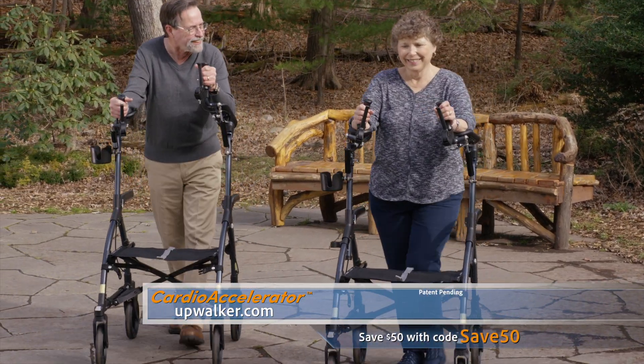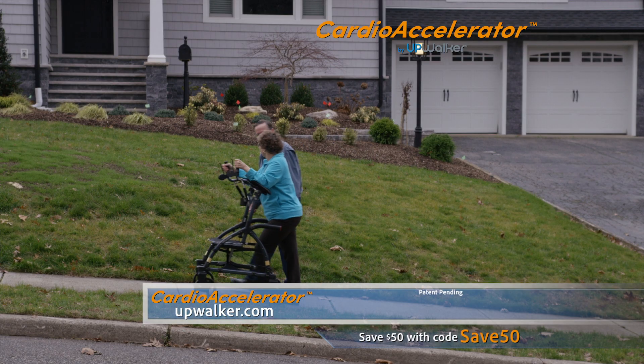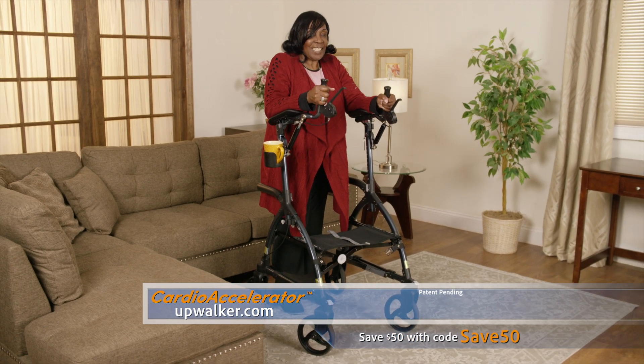Whether you use it as an exercise machine or as the original UpWalker, you can walk farther with less pain and greater stability, all while improving your health and well-being with the revolutionary Cardio Accelerator.